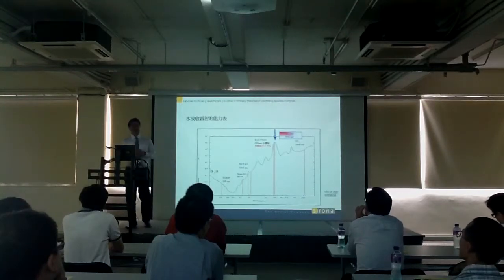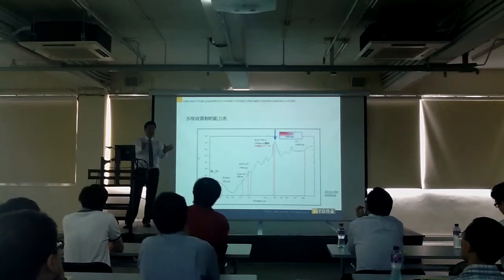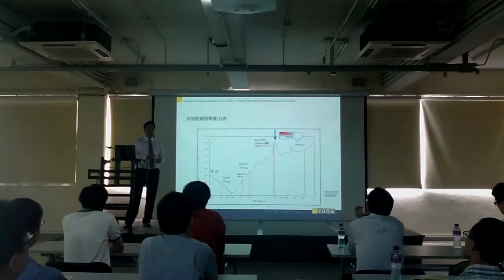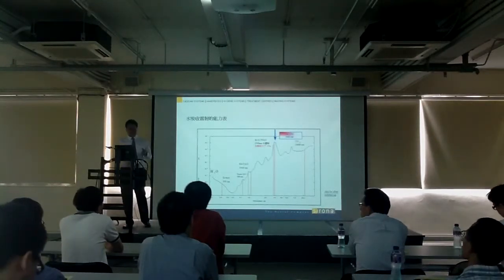It means if you have 100 watts of YSGG laser and 100 watts of erbium YAG shining on two equal amounts of water, the erbium YAG has 55% more energy absorbed compared to the YSGG laser, which means the YSGG laser cuts slower. But we're at the same amount of energy, right? 100 watts. Where does that energy go? It accumulates in tissues as heat and damages the tissue. That's where the scattering goes, what we talked about earlier.